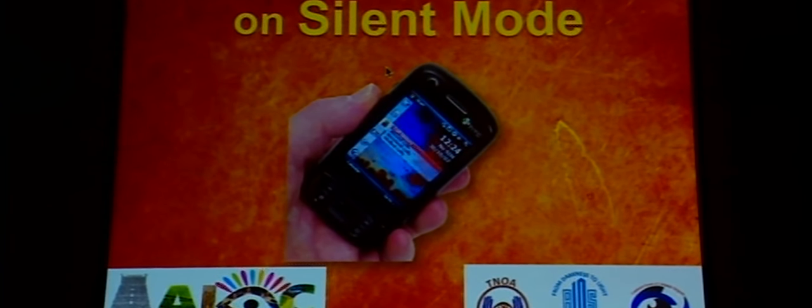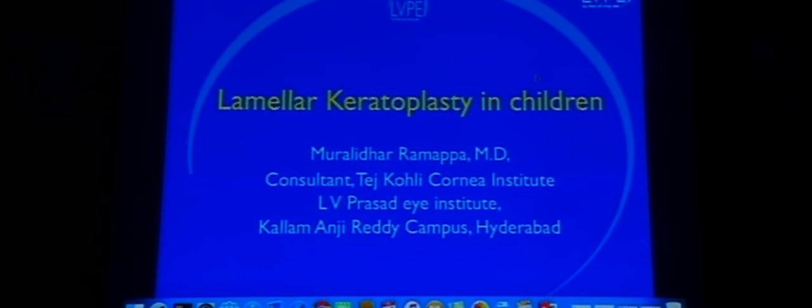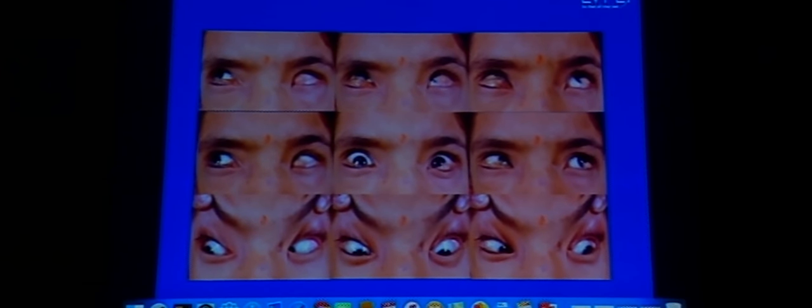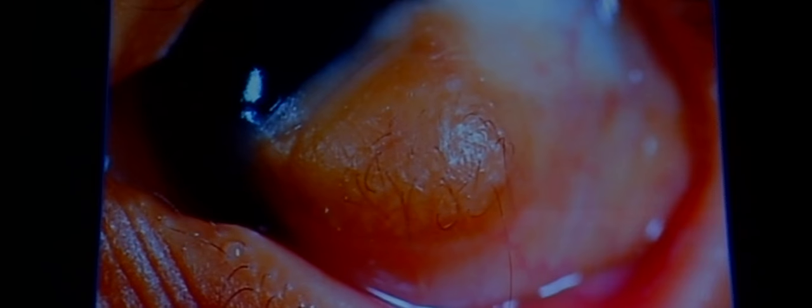Good afternoon. Thank you, Dr. Rishi. I shall be sharing clinical pearls on anterior lamellar keratoplasty in children. I have no financial disclosures. This is a typical case of corneal dermoid — 30% of cases have bilateral involvement. The condition affects both cosmesis and vision, as well as extraocular motility. This child had undergone simple excision elsewhere, resulting in a dense pannus encroaching on the visual axis and causing cosmetic blindness.